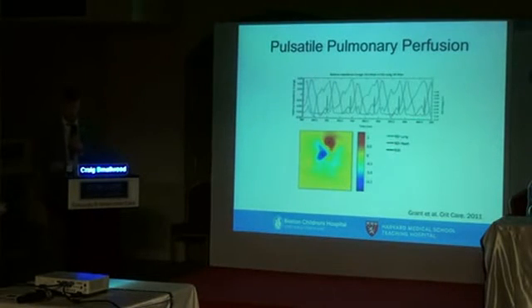So I have a few more diverse applications of EIT that I want to introduce to you. I think the most obvious is ventilation and distribution of ventilation. The most research has been done there. But I think researchers are keen to join the other component of ventilation, and that is perfusion. If we can match ventilation to perfusion in all of our subjects, we will maximize the ventilation and thereby give us the best chance to reduce ventilator lung injury.